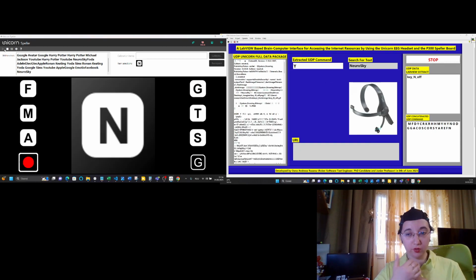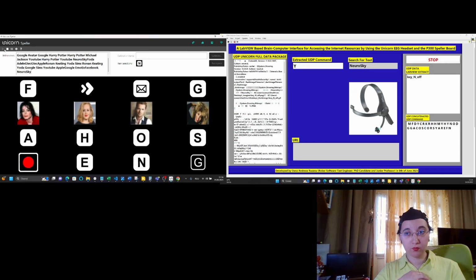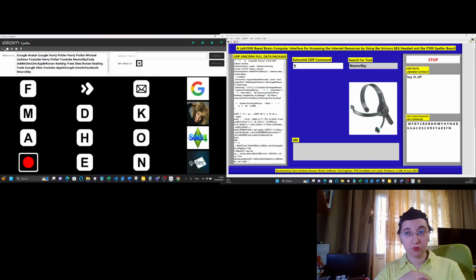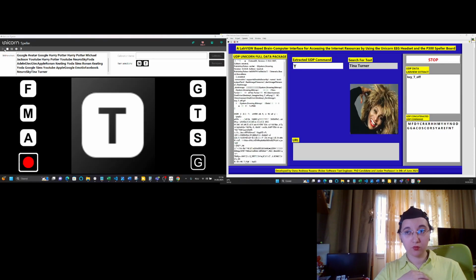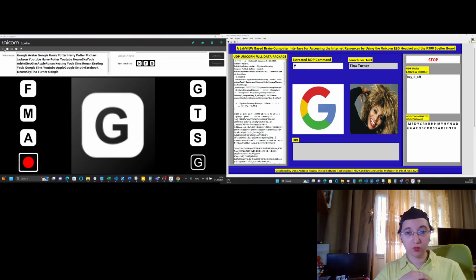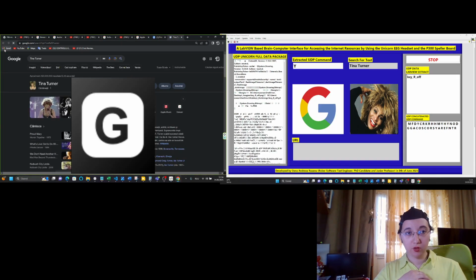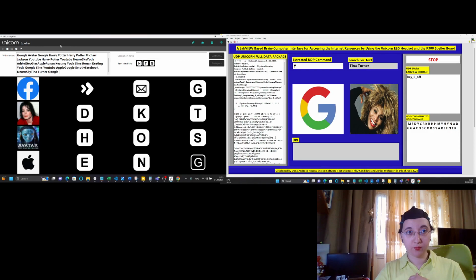Okay, Neurosky was selected. And now Google. Yes, Google was selected. You can see the searched option is Tina Turner and the related content was already displayed.